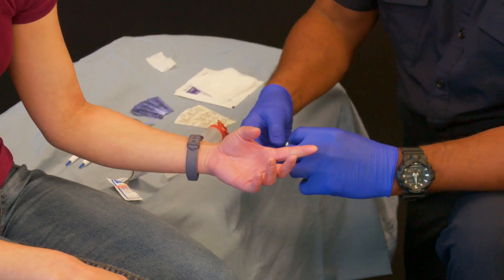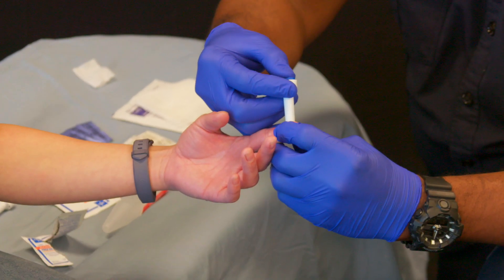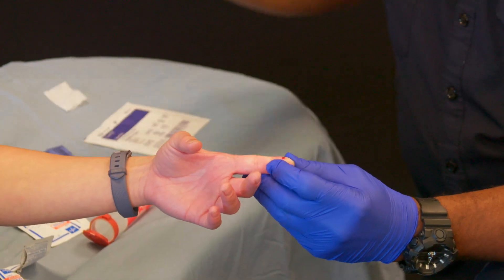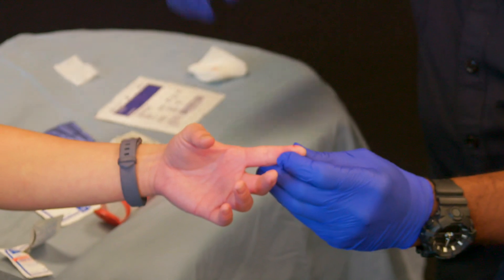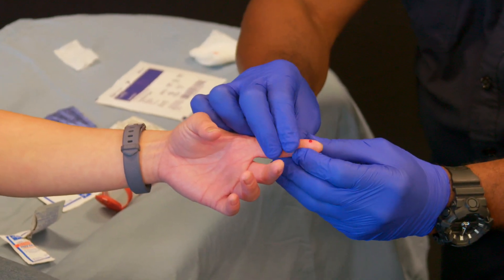Using the lancet, I will puncture the lateral aspect of the finger. Once a blood drop forms, I will wipe that blood drop away using the gauze pad. If needed, I can squeeze the finger gently to form another drop of blood on the finger.